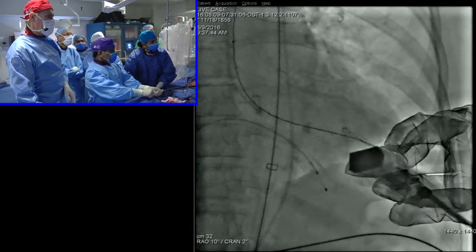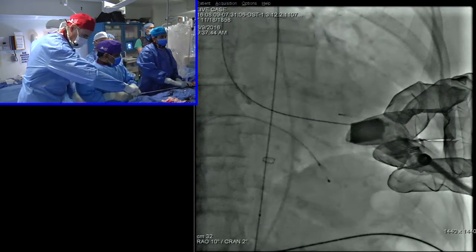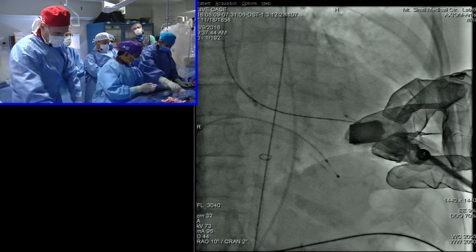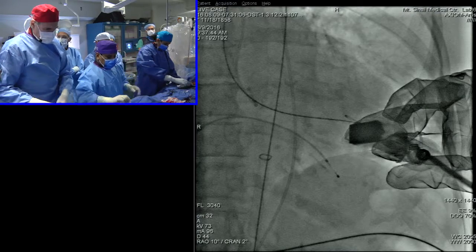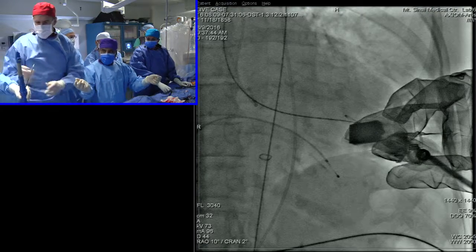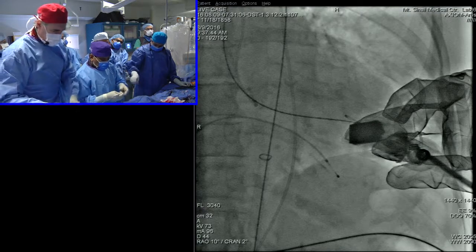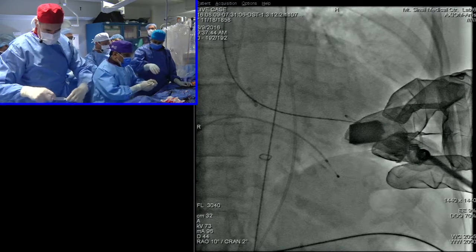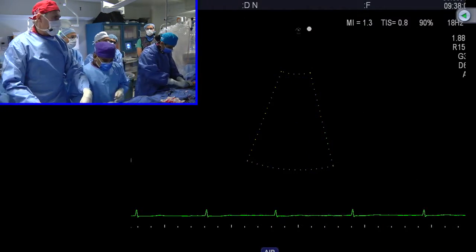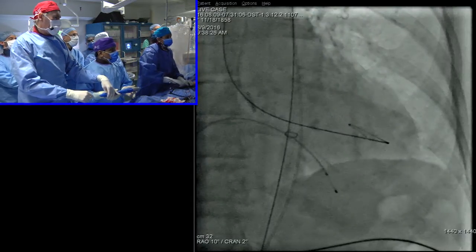To my knowledge, any of the valves, independent of balloon-expandable or self-expandable, had no difference in stroke in this procedure. Right. Well, that's actually the issue coming up now. The only randomized trial of the choice was the SAPIEN, Edward SAPIEN and SAPIEN XT. There was numerically a little lower stroke with the CoreValve compared to the SAPIEN, but now with the SAPIEN 3, as you saw in the PARTNER 2A high-risk and intermediate-risk SAPIEN trial of 1,000 patients, the stroke rate is very low now, 1%.